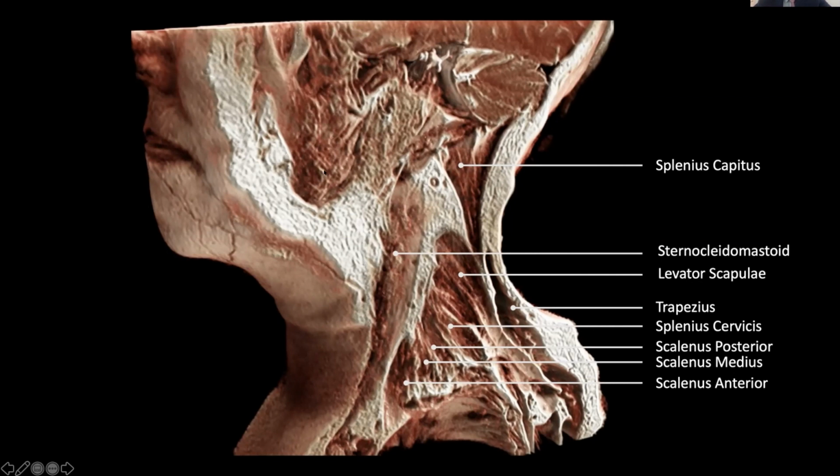I feel like if there's an area of anatomy you've never learned, it's always good to start with the 3D and get a broad sense of what you're dealing with, and then work backwards. So you go from the 3D to the CT or the MR, and then to the plain film, which is kind of the opposite of what everyone learns, because the plain film is actually the hardest to understand, because it's the one furthest away from reality, right?